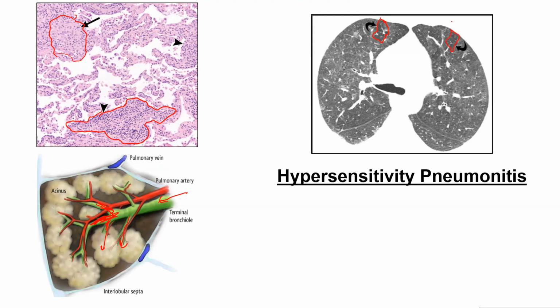You need to specifically do an expiratory scan for this. When they breathe out on the expiratory scan, the air gets trapped, and because it gets trapped, that parenchyma looks a little bit darker because it still has more air in it. They can also even get wheezing because of that. So it also affects the alveoli, but mostly the terminal bronchioles are the anatomic unit that it really affects.